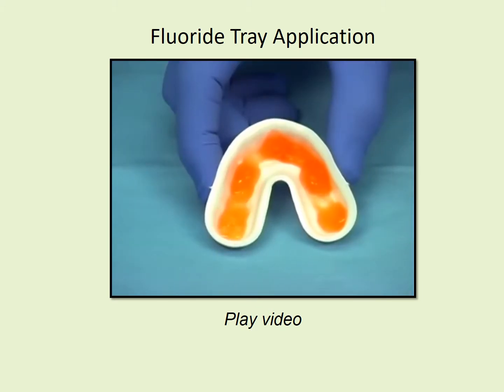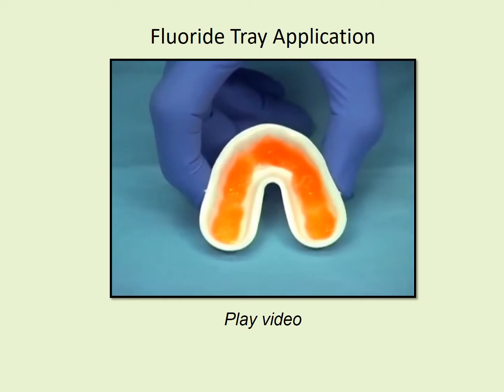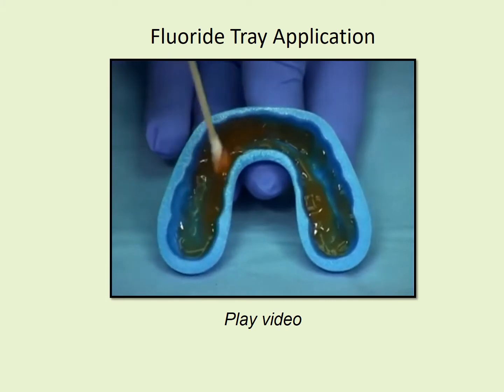The fluoride gel can also be spread by tapping it on a hard, clean surface. Another method to spread the fluoride gel is to use a cotton tip applicator.